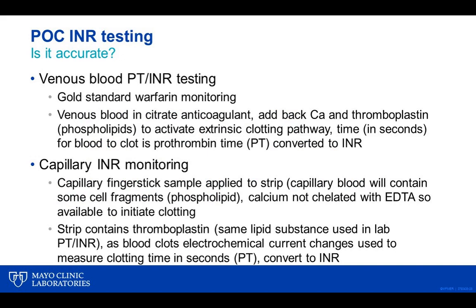But does point-of-care INR work? And certainly we've had this amazing time of pandemic and time to ask a lot of questions, and I like to go back and not take things for granted. So to me, with an interest in point-of-care INR monitoring, having published some papers, it's pretty amazing this works. When we talk about biochemical testing and cell counts, I already told you there are limitations physiologically, but it works okay.